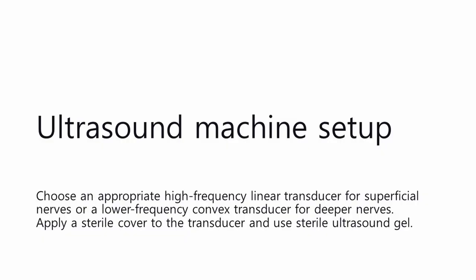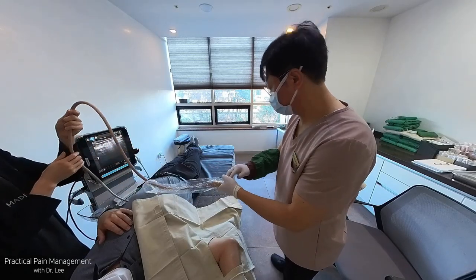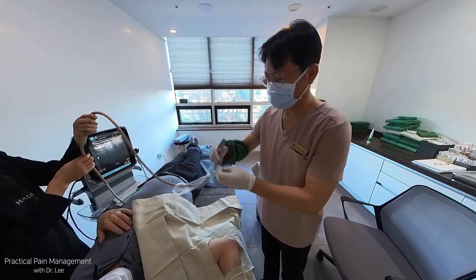Ultrasound machine setup: Choose an appropriate high-frequency linear transducer for superficial nerves, or a lower-frequency convex transducer for deeper nerves. Apply a sterile cover to the transducer and use sterile ultrasound gel.